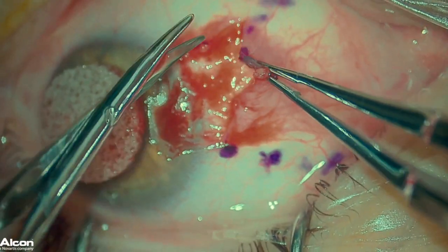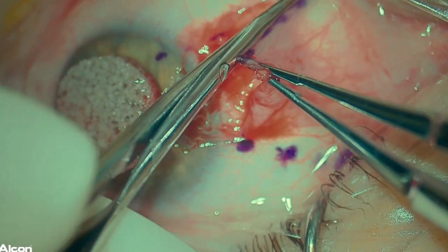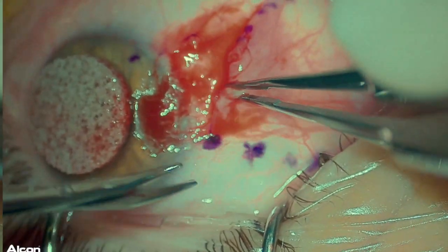The pterygium is then dissected using the Westcott scissors. I use a combination of blunt and sharp dissection, taking care to avoid damage to the medial rectus muscle which is in this area.